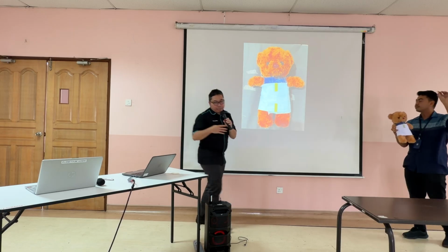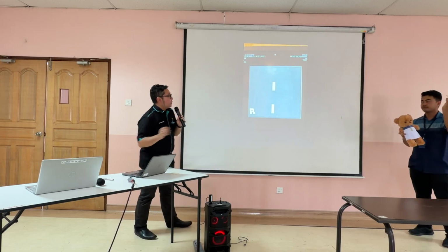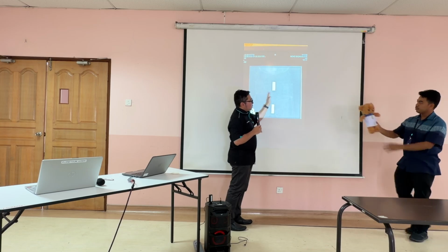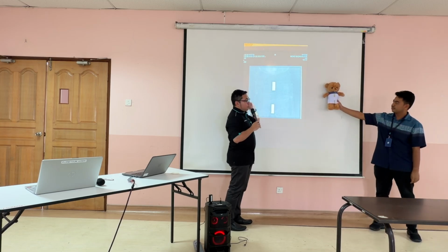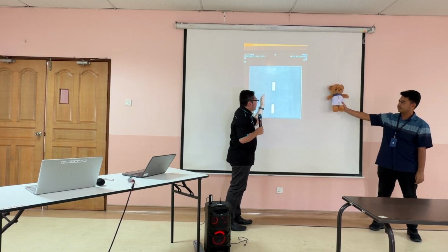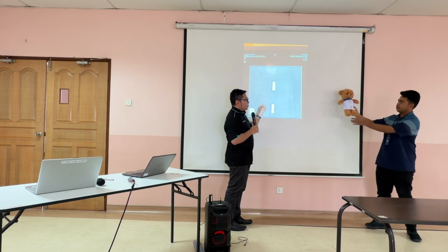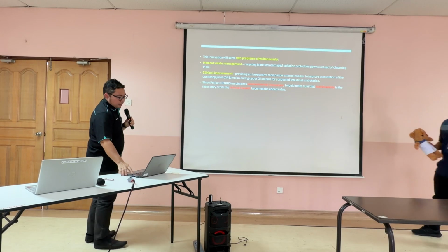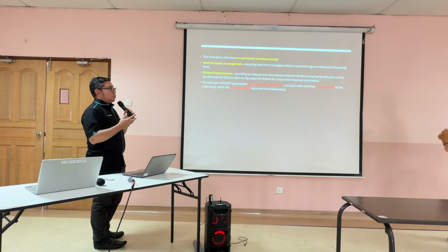So when we image the study, we will put that here. We make sure the patient is centered, so the contrast will be on the left side. If the contrast is not crossing toward the left, I'm sure this is malrotation, but if the contrast goes to the left side, I'm sure this is normal. So this innovation will solve two problems.